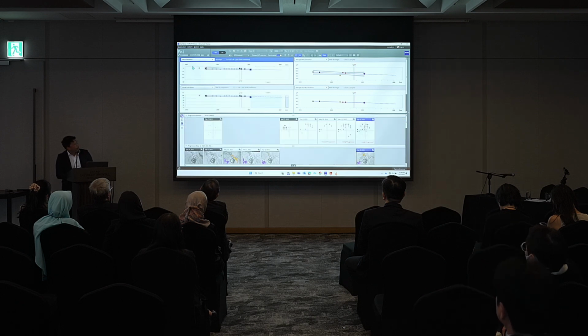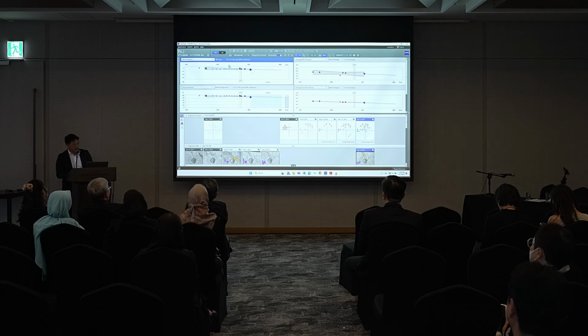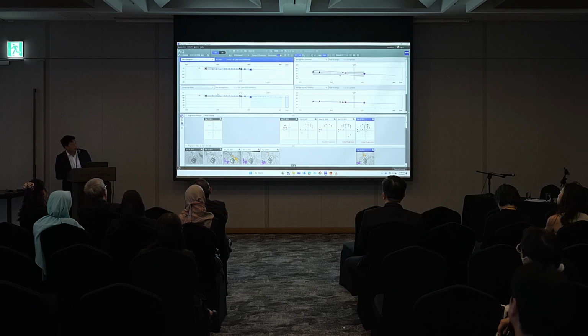And here we can actually tell Zeiss to forget about everything the patient had before. This is going to be our new baseline. Patient, this is where you've had surgery, and this is where things are definitely going downhill. There we've got the mean deviation slope. We can see that this patient's VFIs are relatively rapid at minus 1.3 based on their new progression, which is not clouded by the previous slope.